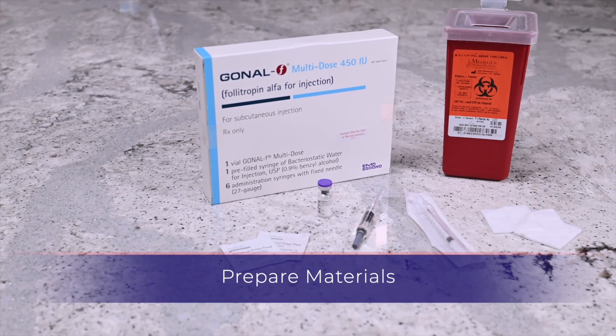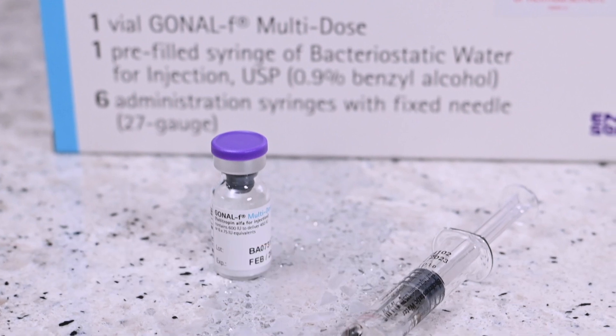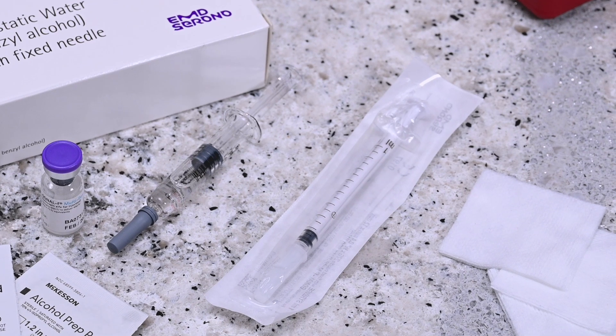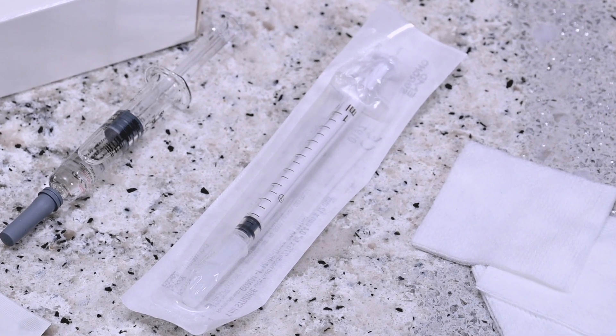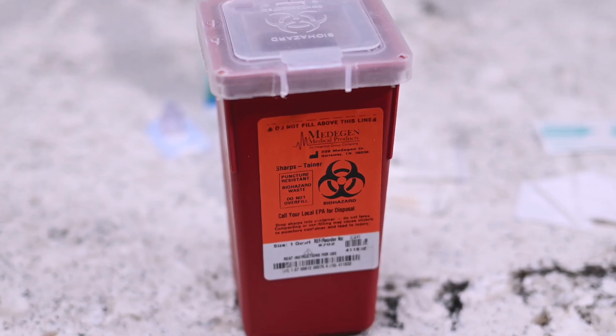You will need the following: a vial of Gonal F powder, a pre-filled syringe labeled bacteriostatic water, a Gonal F multi-dose custom dosing injection syringe provided with the medication, alcohol prep wipe, gauze, and a sharps container.